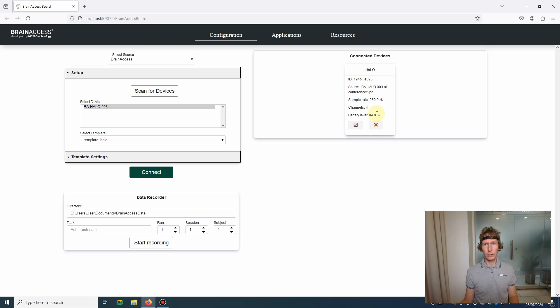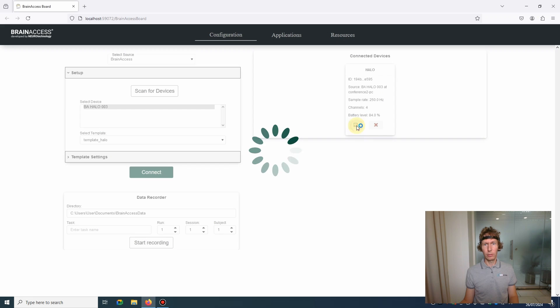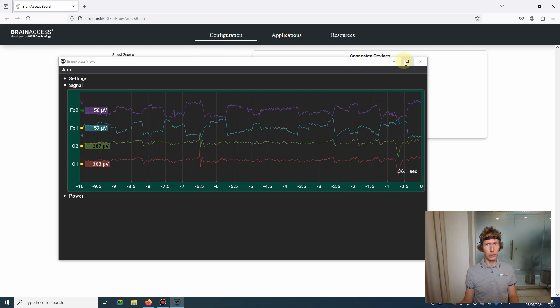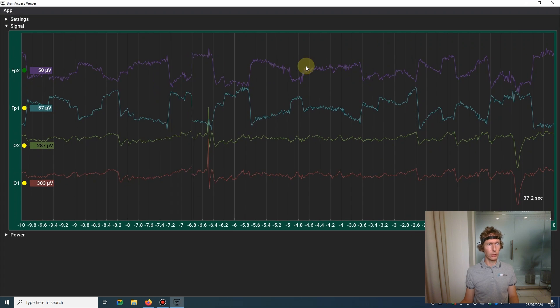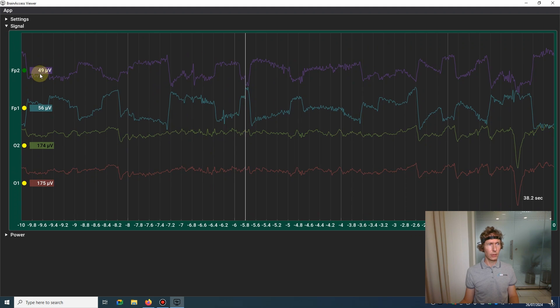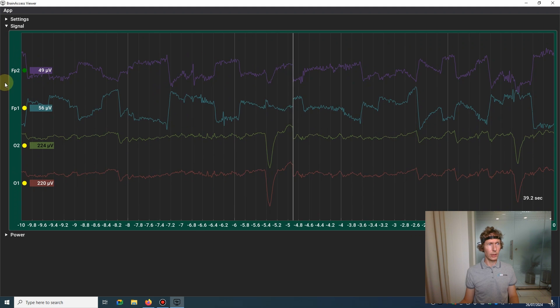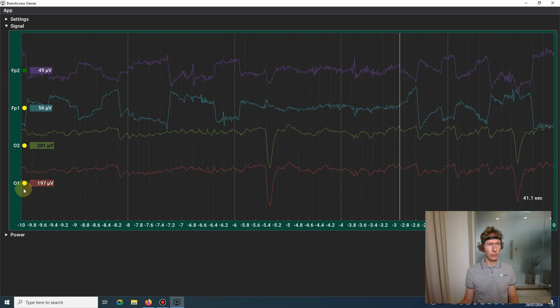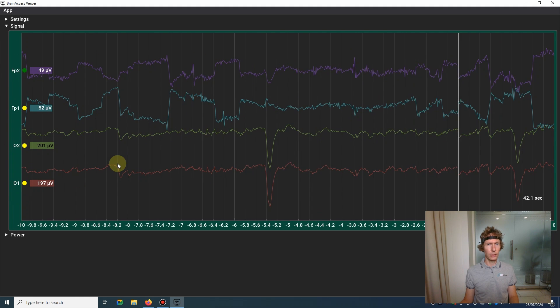If you press the graph button here, it will bring you straight to the Brain Access Viewer and you can check the signals and check if everything's all right. As mentioned previously, the halo has two electrodes in front and two electrodes in back.